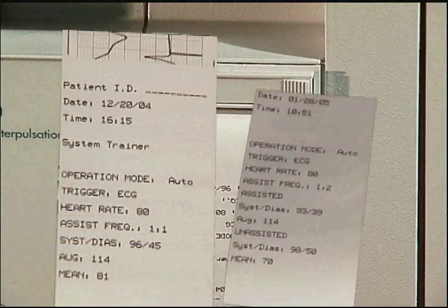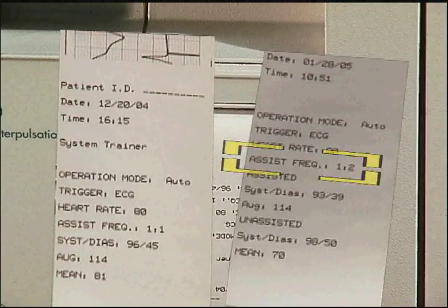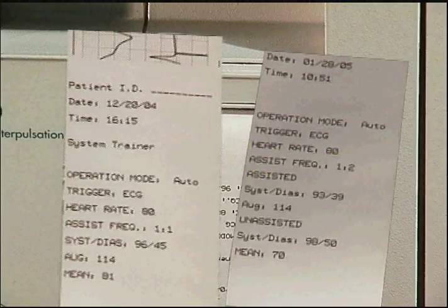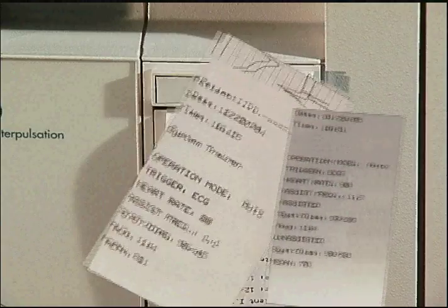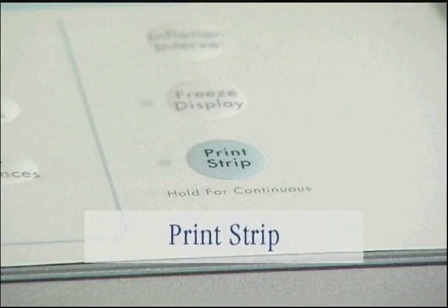When 1-2 or 1-3 is selected as the IAB frequency, the recorder will print both assisted and unassisted systolic and diastolic pressure information. To create a static printout, press the PRINT STRIP key here.